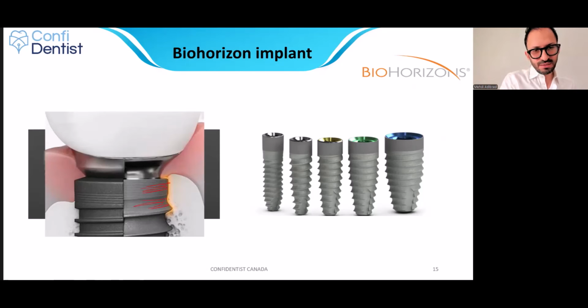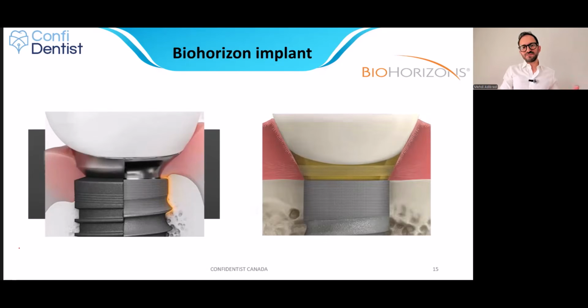This is the implant line that has platform switching, bone level with platform switching. But we do have BioHorizons implants without platform switching. So it means that this is flush. Okay. But there is no step. I see absolutely no step there.